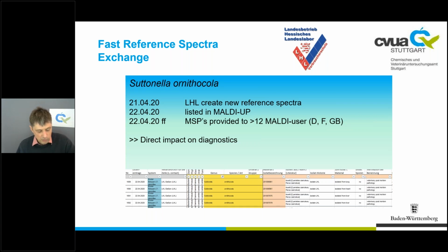They listed these reference spectra in MALDI-UP a day later, and more than 12 other interested MALDI users updated their databases with these reference spectra for so-called Suttonella ornithocola. It's a bacterium not yet represented in the commercial databases. This new reference directly improves the diagnostic possibilities of the laboratories.